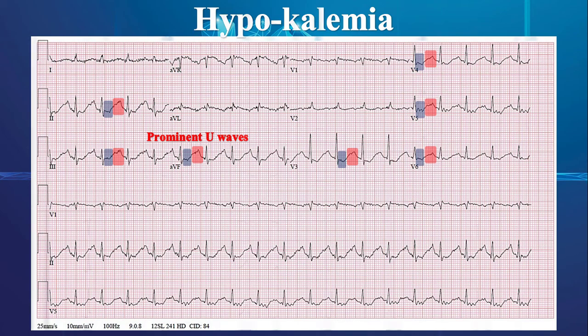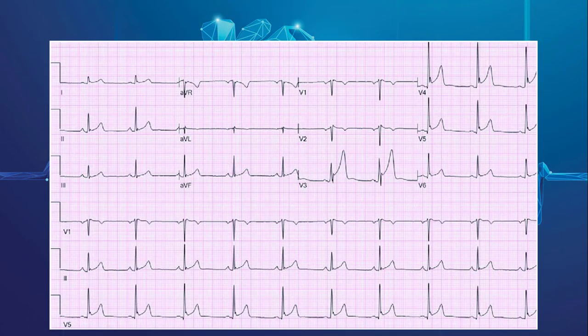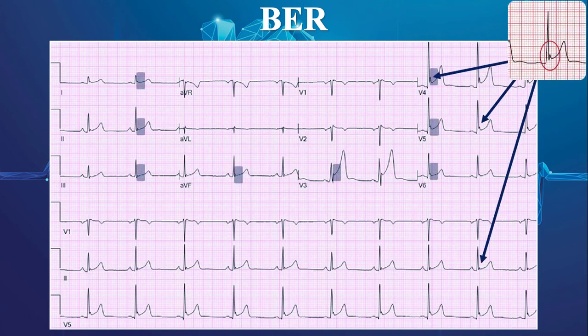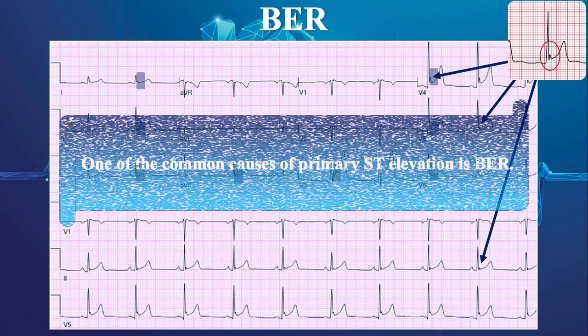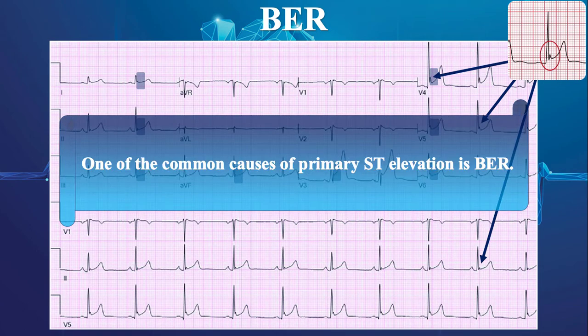The next EKG demonstrates benign early repolarization, or BER. Widespread ST elevations with concomitant fishhook sign and lack of reciprocal ST depression are highly in favor of early repolarization. As we said, one of the common causes of primary ST elevation is BER.